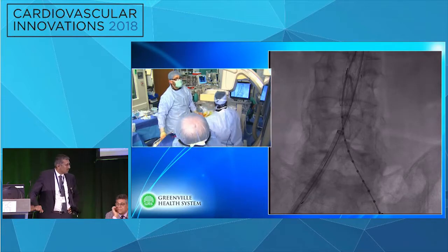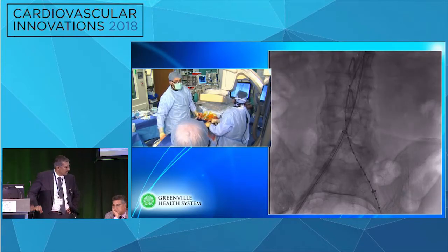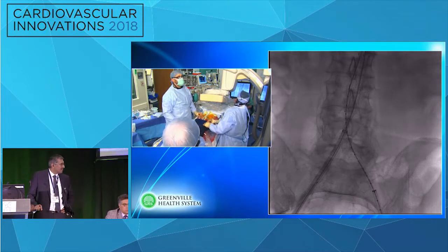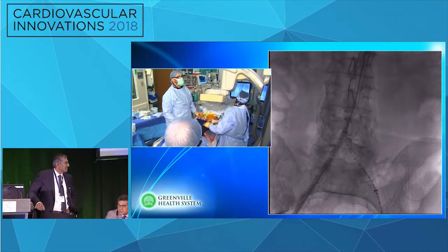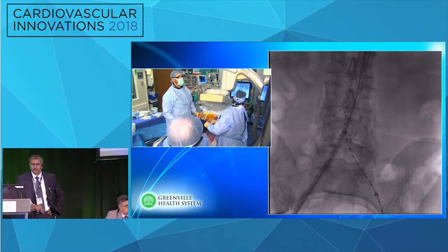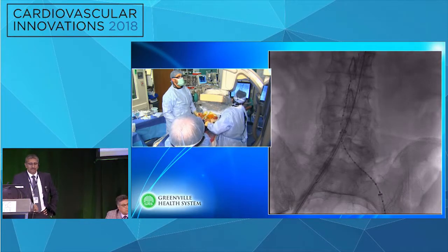If your IVUS is out, that might be a possibility. Okay, great. Go ahead and pull the wire back a little bit, please. That is probably the best way to do it. Yeah, we would just IVUS it. I mean, you can tell absolutely, with no doubt about it then.